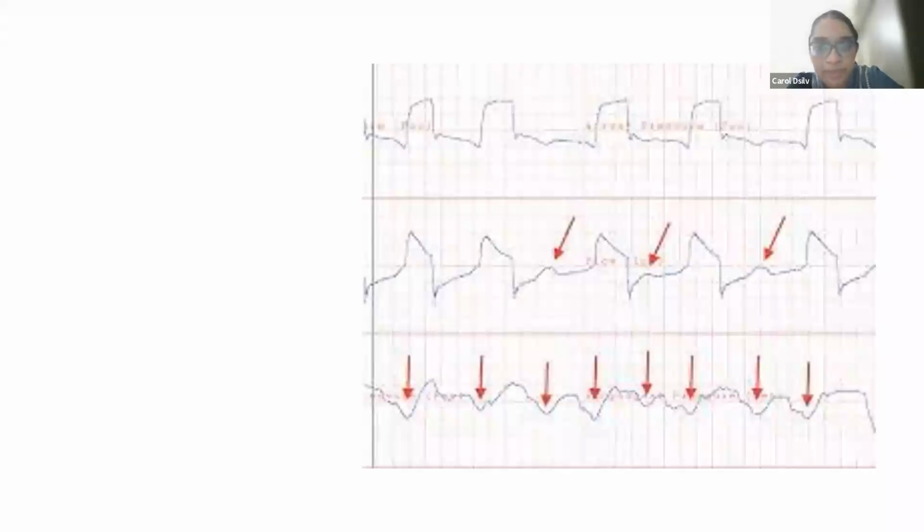This is a little tricky, but it may or may not be asked for you all. I'm just moving to 2 slides on some common patient ventilator asynchronies. The first one is a pressure time scalar. The second one is a flow time scalar. This is a pressure controller; you can see the constant pressure, decelerating flow. And this is basically the esophageal pressure that is measured in this patient.